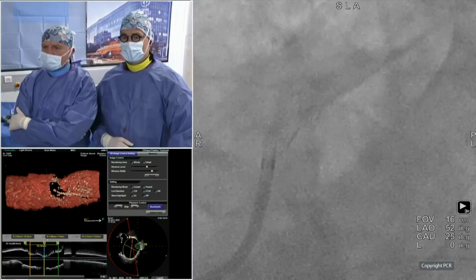Very good. I think we are discussing the OCT coming on the screen. Let me react to your question. I think the slide is not there, but are they ready for the OCT? Do we know that? I don't know. We can come back to those.